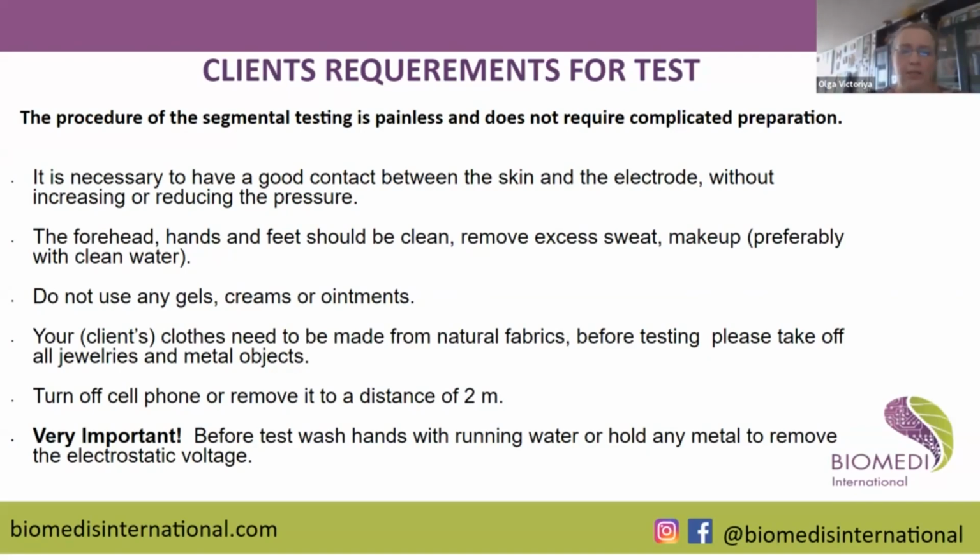Also, our client and operator, we all need to turn our cell phones off or put them at a distance of 2 meters from the testing area. Very, very important: before the test, you need to wash your hands with running water, both of you, or hold your hands on some metal. What it does, it removes all the electrostatic voltage, so we will not destroy the device, okay?